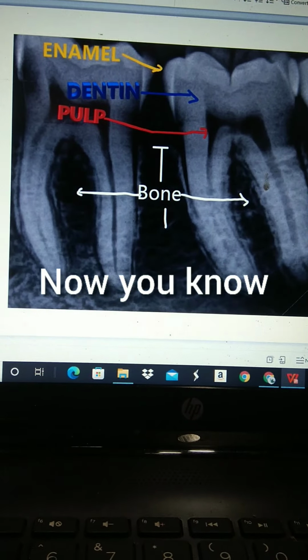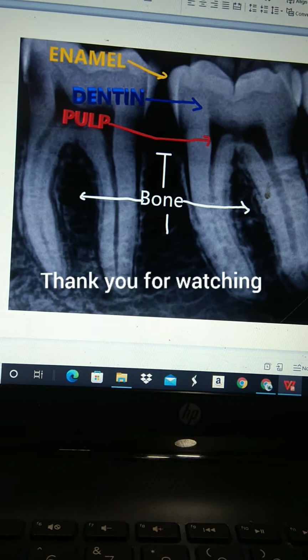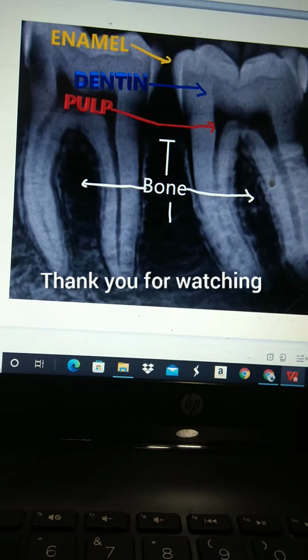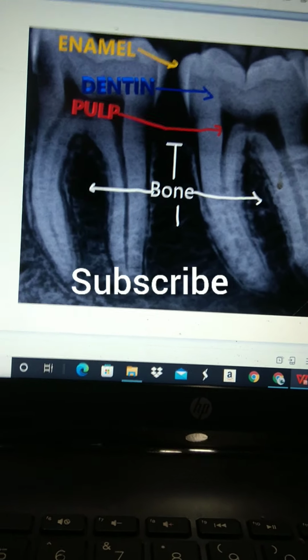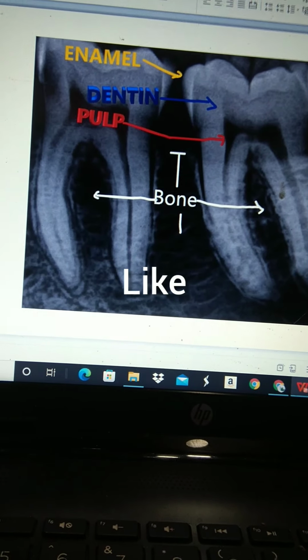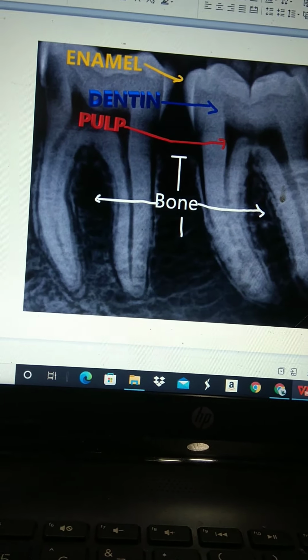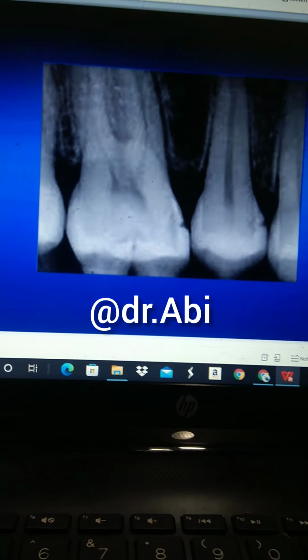If you have acute carious activity in your mouth, get x-rays every 6 to 8 months. If you do not have a lot of caries activity in your mouth, then continue with your oral hygiene habits, but get x-rays of your back teeth at least once a year. Very important to diagnose these small cavities.